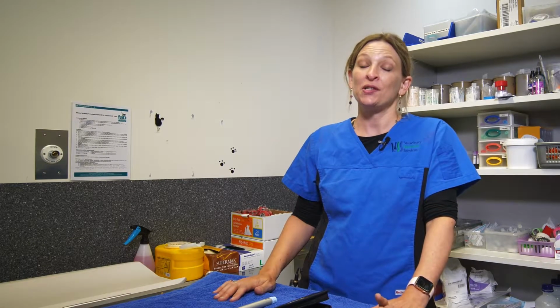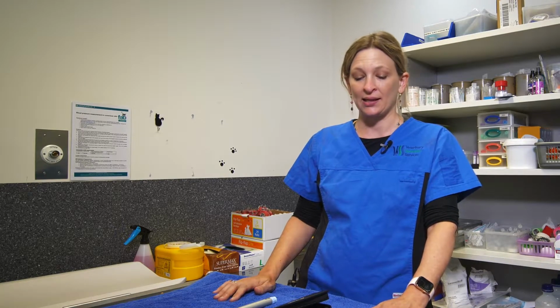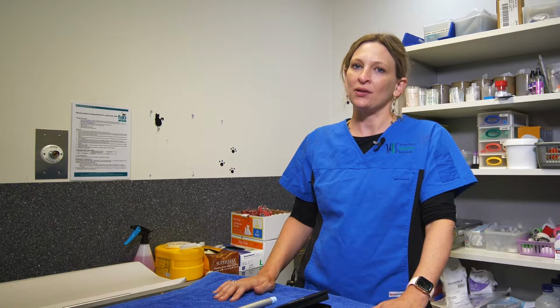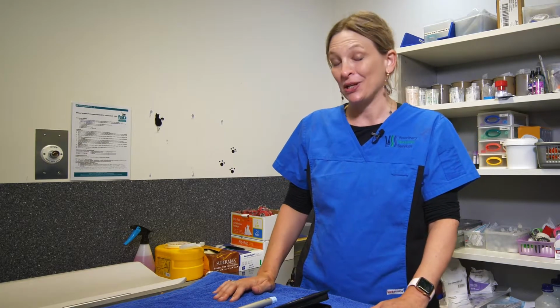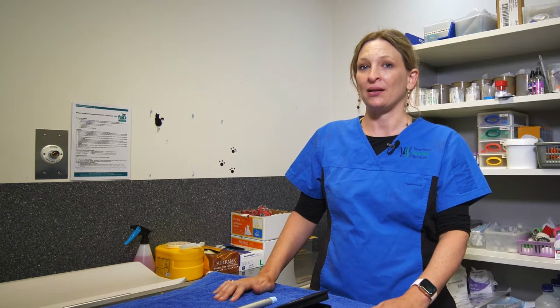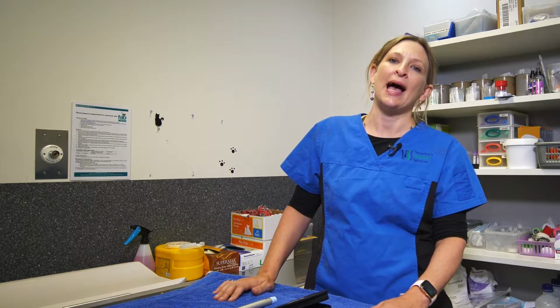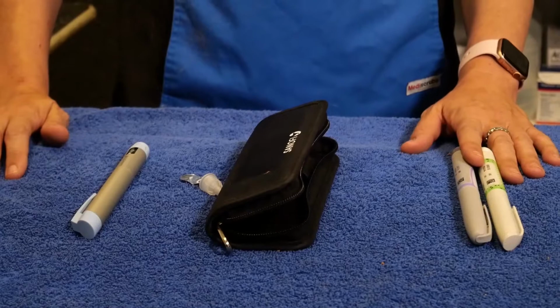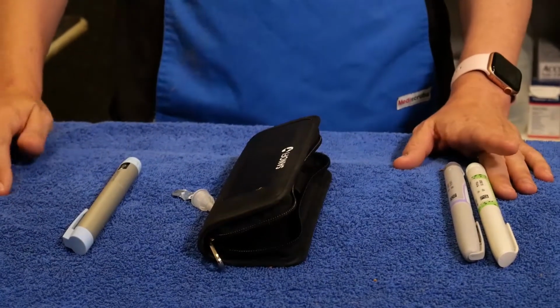I'm the feline specialist with Veterinary Specialist Services, and this short video is just to provide you with some information on the use of insulin pens in cats. We might have recommended the use of an insulin pen for you if your cat has been diagnosed as diabetic. The benefit of using an insulin pen is that it gives us much greater control over the much smaller doses of insulin that we might be using in diabetic patients.